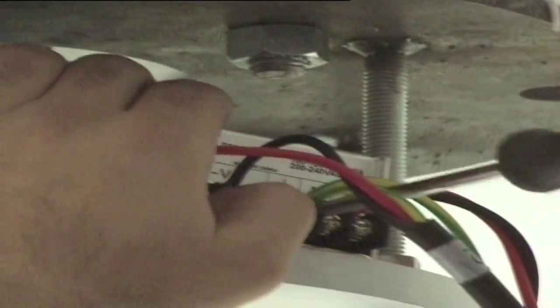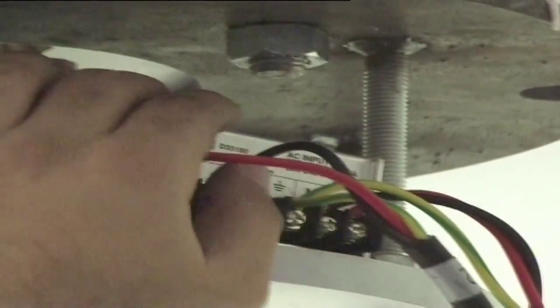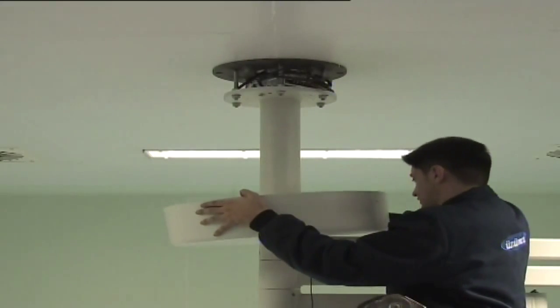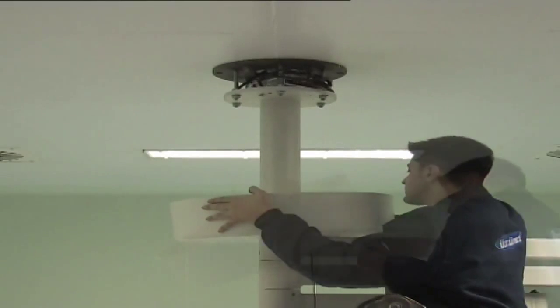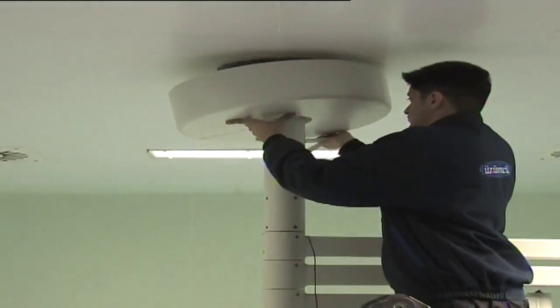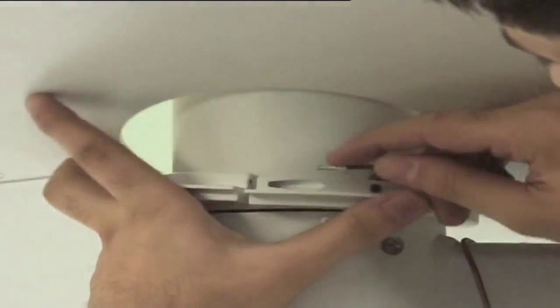After electrical connections are made and checked, loosen screws on the 2-piece chimney hood cover of the tubular flange. Insert chimney hood to tubular flange from both sides. Tighten 6 screws to fix chimney hood pieces. Insert bracket to tubular flange so as to leave screws outside. Tighten 2 screws near the bracket by using an Allen wrench.